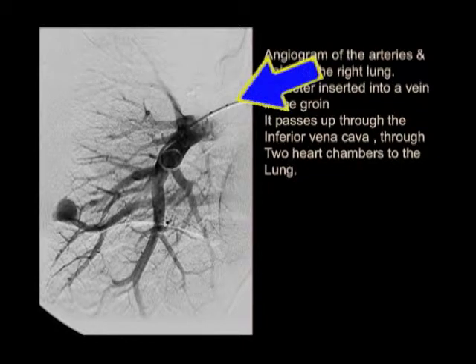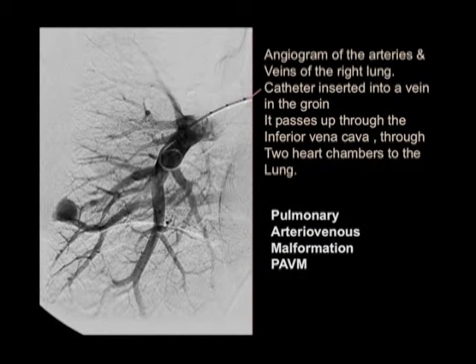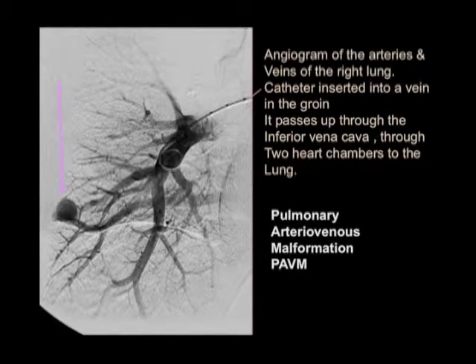This is an angiogram of the arteries and veins of the right lung. Our catheter came up from the groin, passes through the inferior vena cava, through the two heart chambers to the lung. The black stuff is dye that we're injecting, and we actually see a thing called a pulmonary arteriovenous malformation — a connection between one side of the circulation and the other, bypassing the lung.